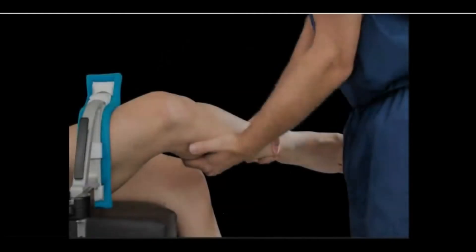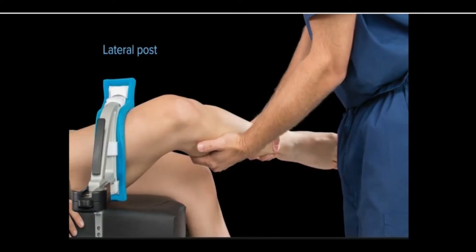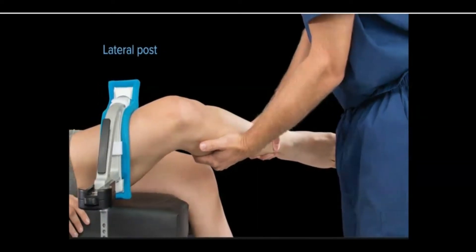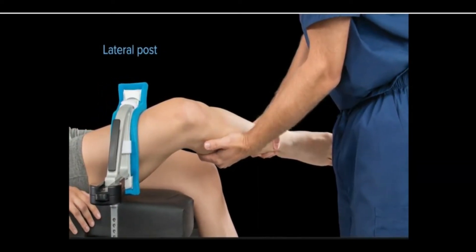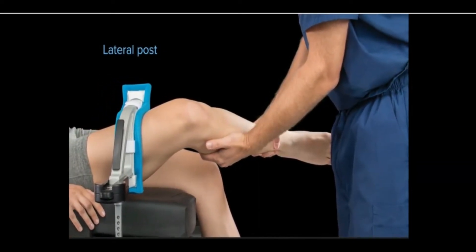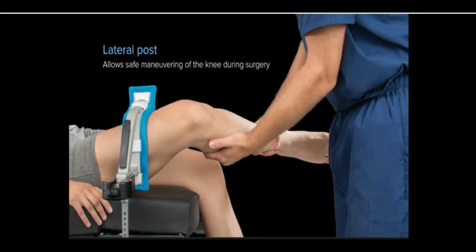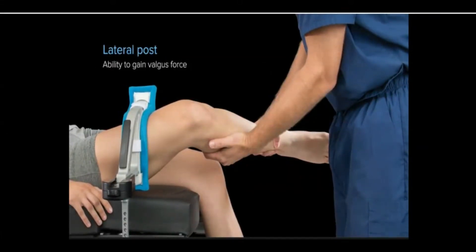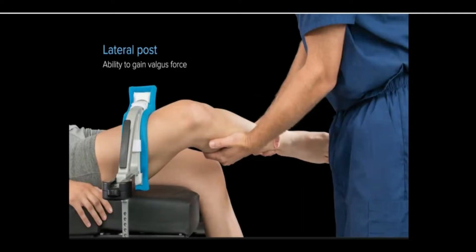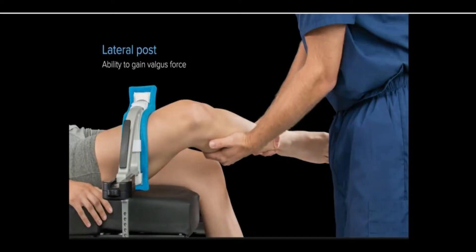Use an appropriate leg-holding device such as a lateral post depending on the procedure to be performed. This type of post allows safe maneuvering of the knee during surgery as well as the ability for the surgeon to gain a valgus force for easier entry into the medial compartment.